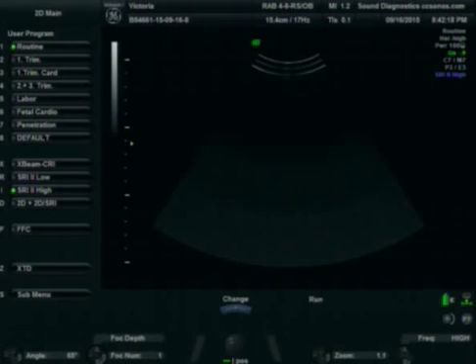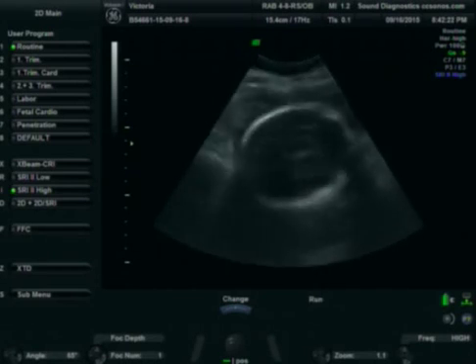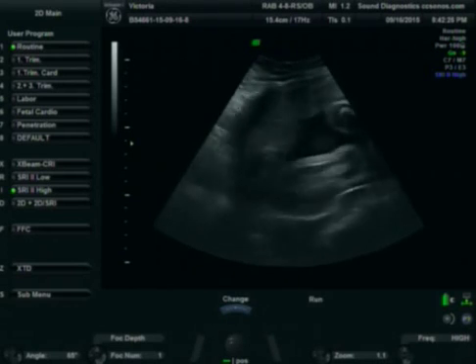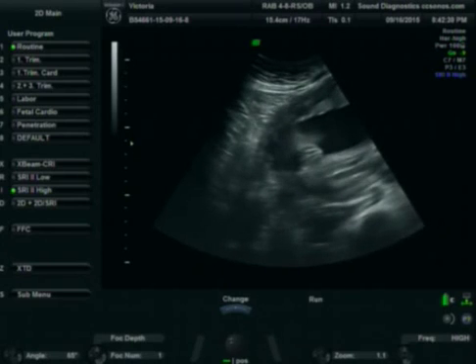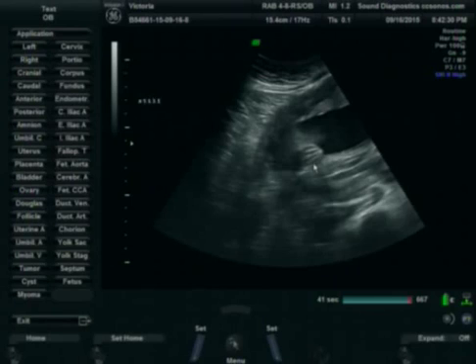So baby number 4, you only need a few more to catch up to us. I saw that. Baby's head is down and the butt is up. So where's her butt at? Right here. Right there? And her head's on this side? So there are the 3 lines: 1, 2, 3. Some people say hamburger. Top bun, bottom bun. That's our baby sister.